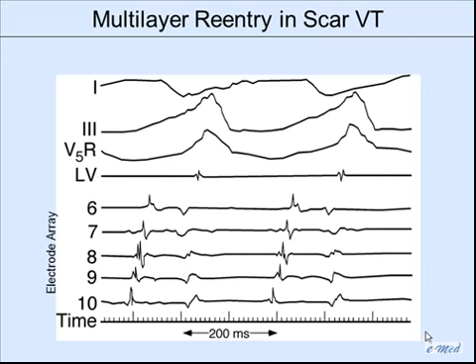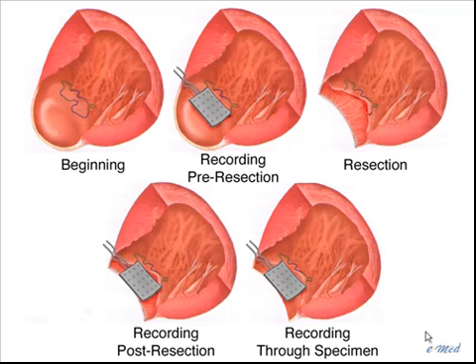And what is a different example here, where during this run of electrograms there's this consistent coupling, where there's a diastolic component and a systolic component, and almost always the diastolic component was sharp and very superficial, and the systolic component is very muted. And we decided to investigate this a little bit further with some studies using this multipolar electrode array.